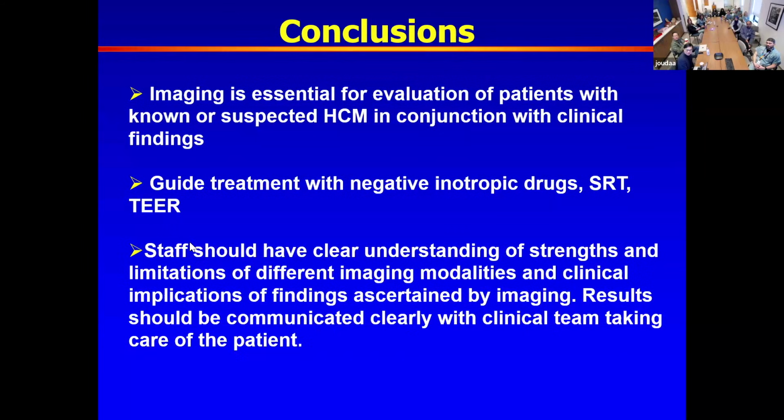Oh, there's one from online again. So do you document, this is a good one, we had a round on this last year. Do you document postprandial period or give patient instructions around eating? Because there's a whole discussion about symptoms after eating in hypertrophic cardiomyopathy. It's a great point. I think labs should do that. And I'll tell you an actual case. This was a patient who was already on mavacamten, not in the initiation phase, but in the maintenance phase of the drug.